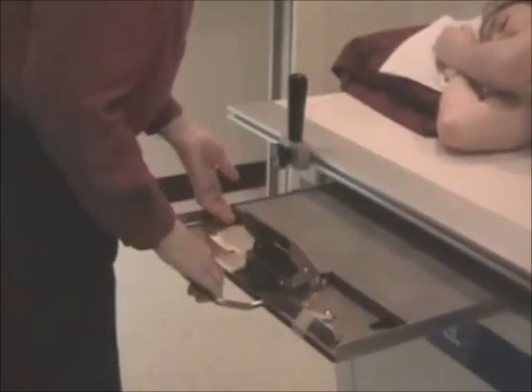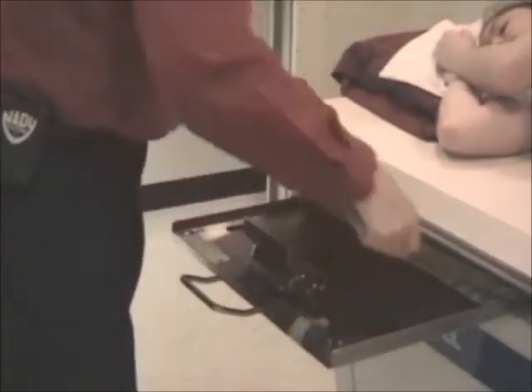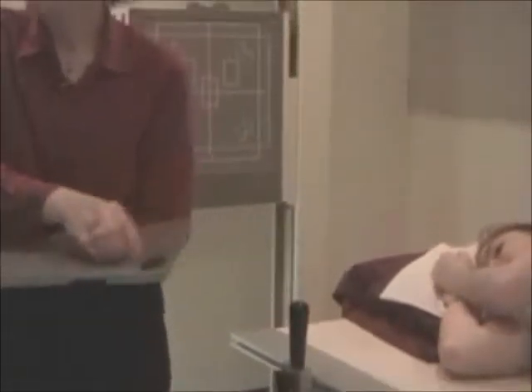What you want to keep in mind is that you don't make the patient move one way, then move them back another way. Think logical and have your patient move, say, in a circle, one direction or the other, so the patient has to move as little as possible. Now, the big films are for the esophagus. We'll move to 10x12s for most of the stomach or the upper GI films.